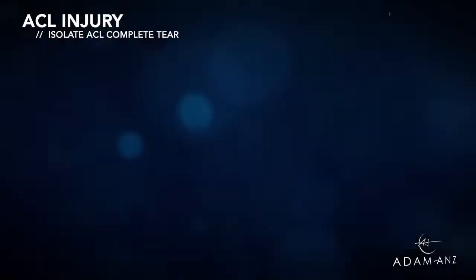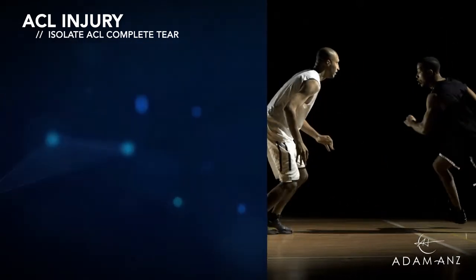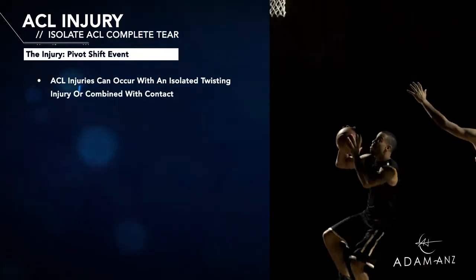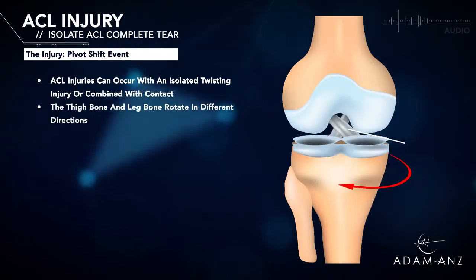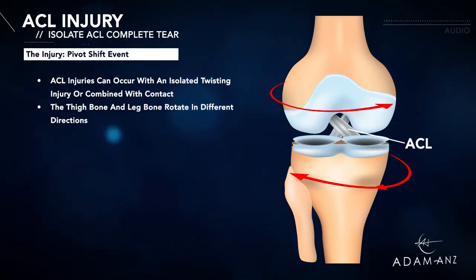This is a case of an ACL injury where there was an isolated ACL complete tear. ACL injuries occur with a pivot shift event. They can be associated with isolated twisting injury with non-contact or with contact. In the scenario of the pivot shift, the thigh bone rotates one direction and the leg bone rotates in a different direction.